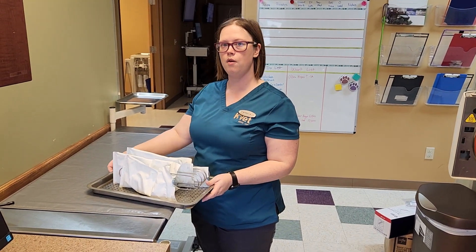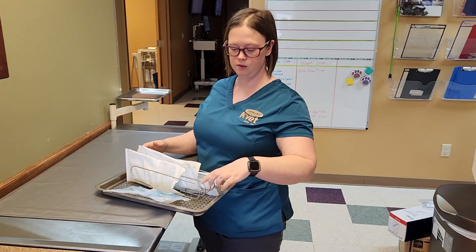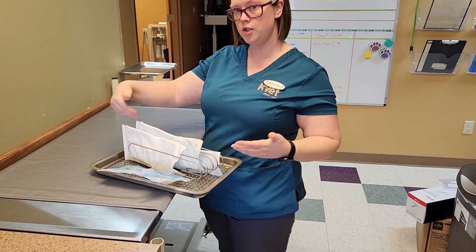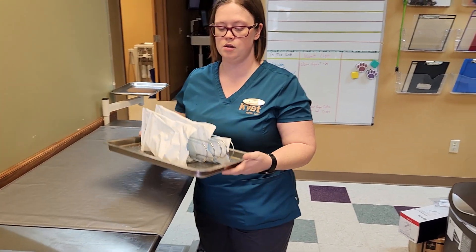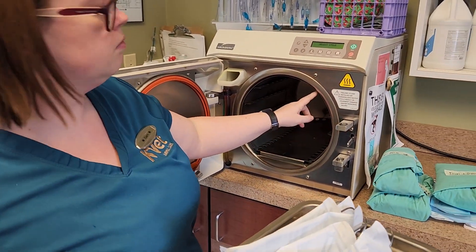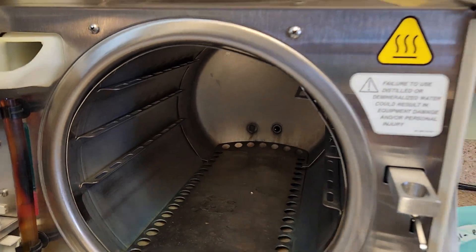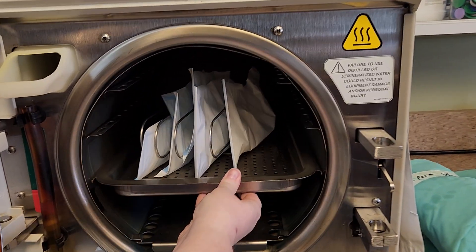We're going to load the autoclave. This first one is with couched instruments. We have little holders that keep them upright and separated so that the steam can circulate and do its job. There are a lot of trays that go and fit in the autoclave, and there are different sizes of trays that can fit in different slots. I'm just going to slide it right in.